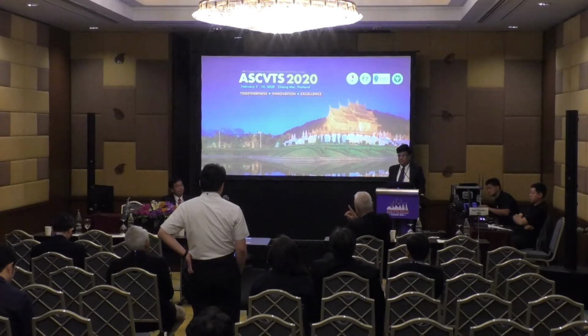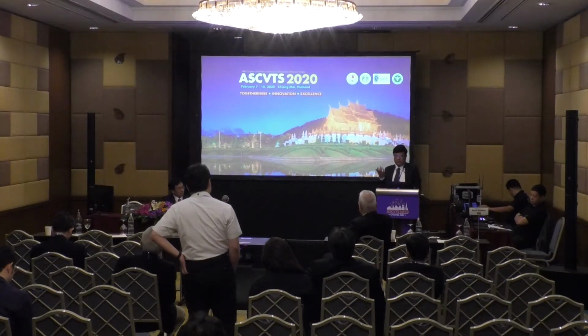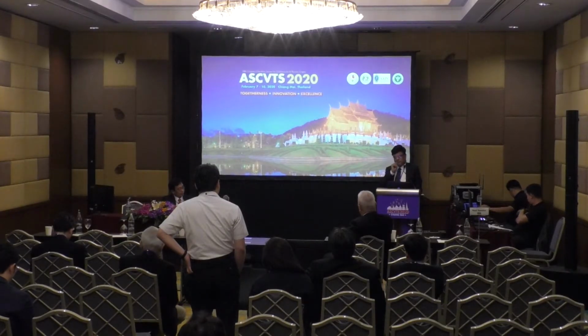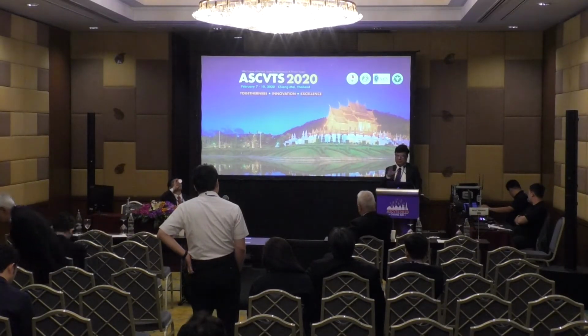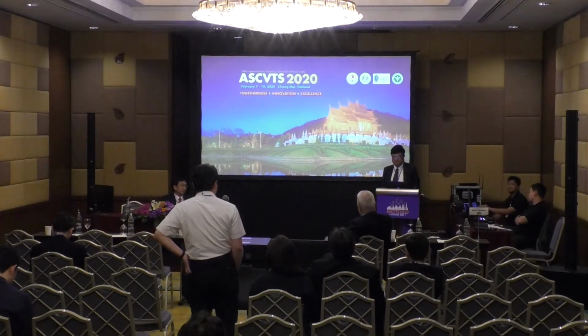Yeah, it helps very much. Yeah, 3D is phenomenal, and nowadays virtual dissection is coming up. Although not everybody is familiar with virtual dissection, I have seen 2 or 3 patients because one of the persons at our hospital is working on it. There's a software for this which is available free of cost online. You can get that software free and feed the CT angio data into it, and it gives you beautiful images. It's almost like you're walking inside the heart, and that helps you predict the level of obstruction and plan your management.